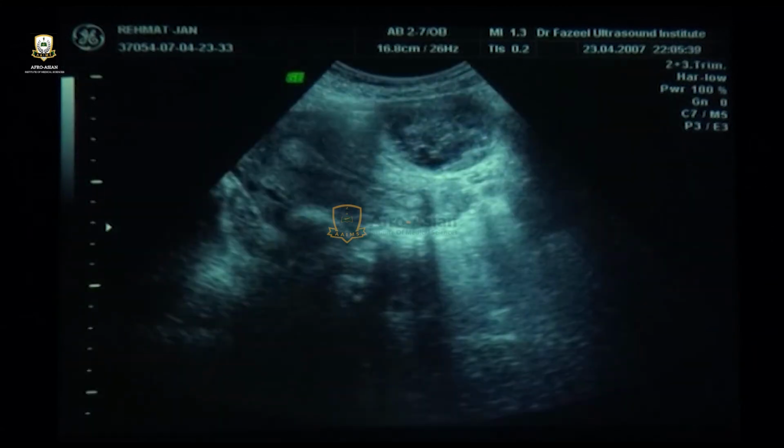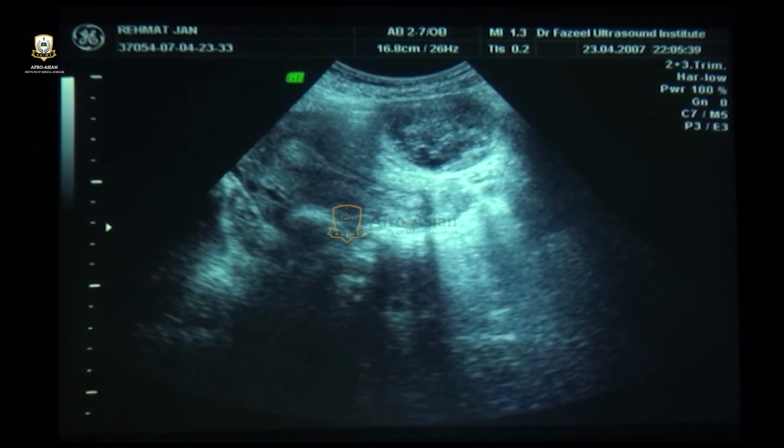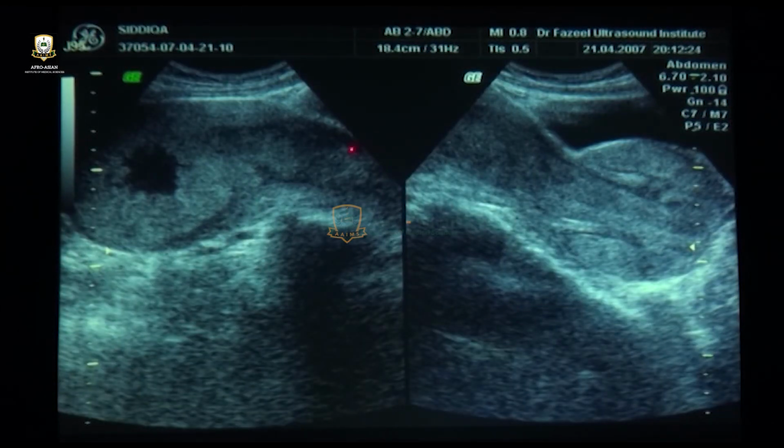Another endometrioma, a simple cyst, a hemorrhagic cyst will become heavier and tend to fall into the center of the pelvis. This is uterus. There is a fleshy tissue coming out of the cervix and surrounding all these areas. This was a case of endometrial carcinoma.